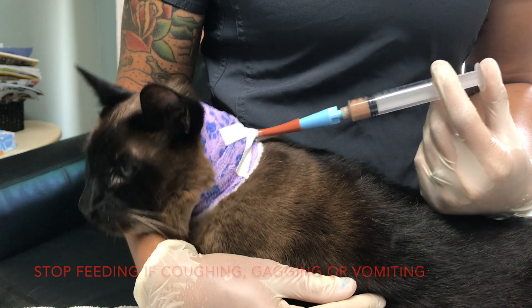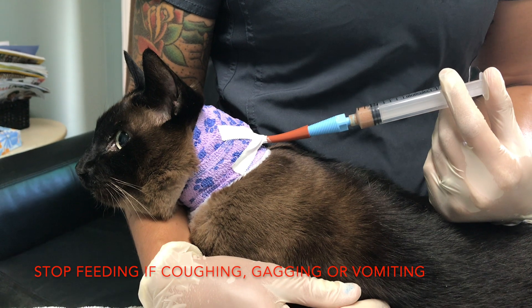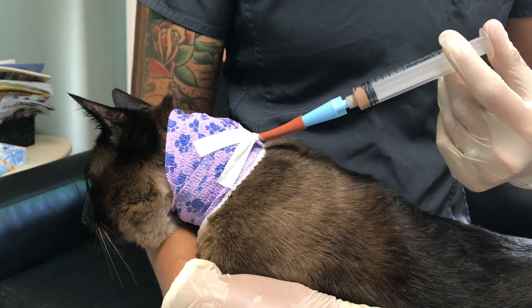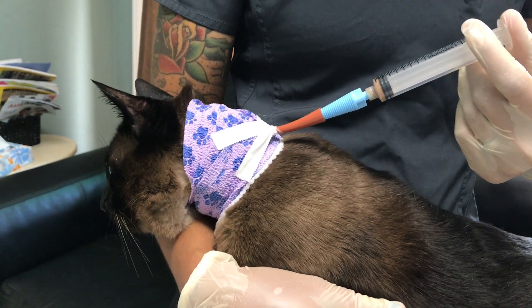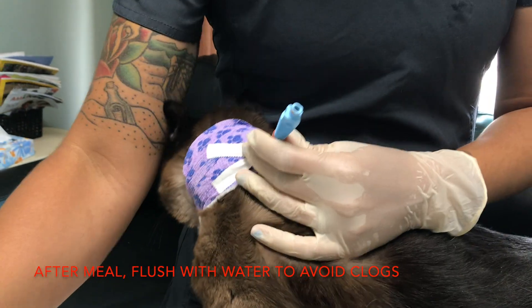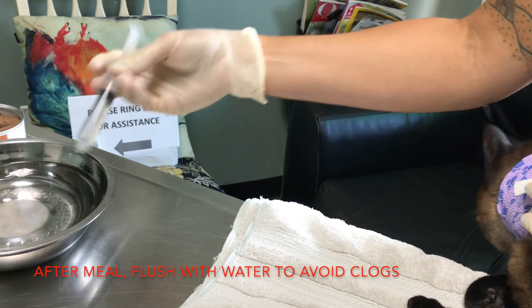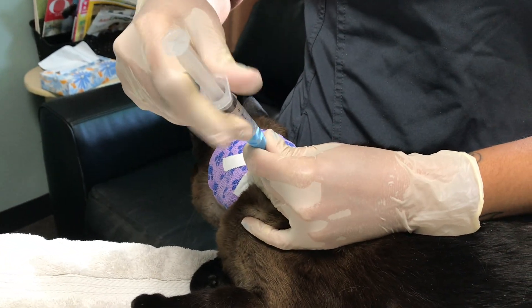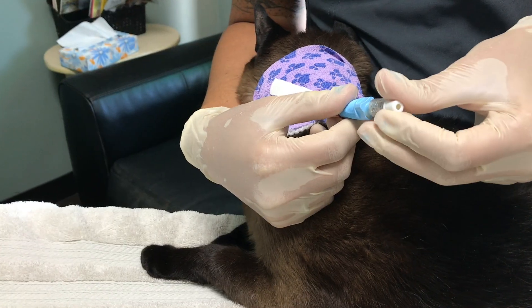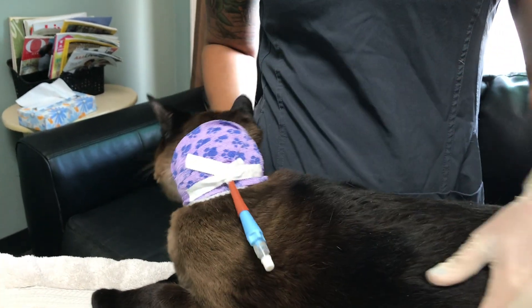If they do try to regurgitate or cough or vomit while administering food, then we do like to stop. After the food is done, I like to be sure that we really flush it with just a few mils of water — again, room temperature lukewarm water — just to ensure that we're not going to get that food dried up in the tube and clog it so we can continue using it. And put our cap back on and he's done — he's free!